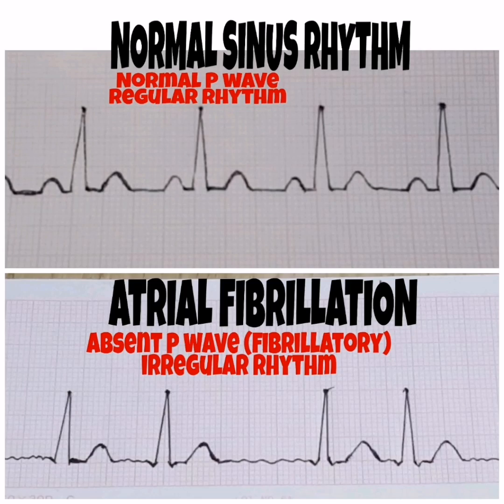The characteristics of atrial fibrillation are absent P waves and irregular rhythm. On top is a picture of a normal sinus rhythm, and at the bottom is a picture of atrial fibrillation. Take a look at the P waves — in atrial fibrillation there is no visible, rounded, and upright P wave. Take a look at the rhythm — it is irregular. Therefore, that is atrial fibrillation.